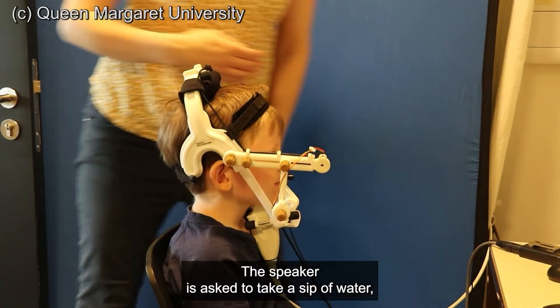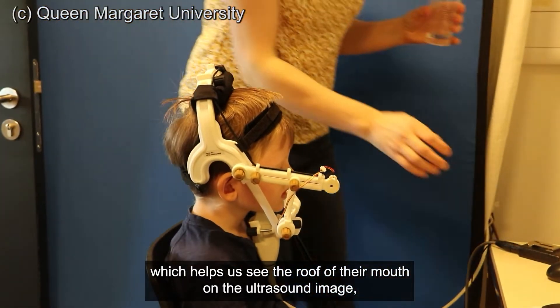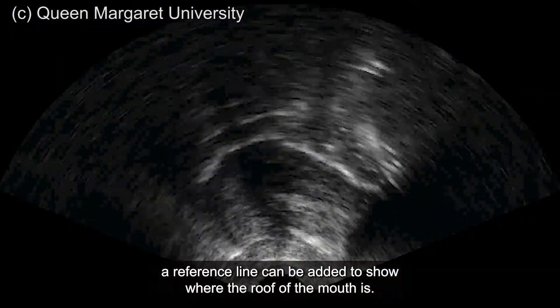The speaker is asked to take a sip of water, which helps us see the roof of their mouth on the ultrasound image. A reference line can be added to show where the roof of the mouth is.